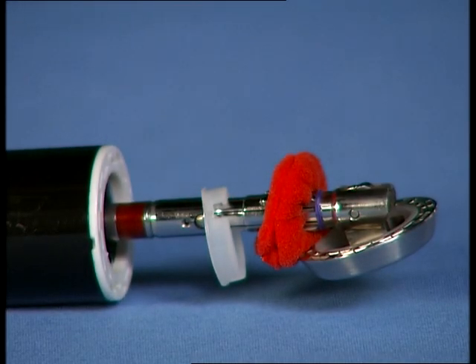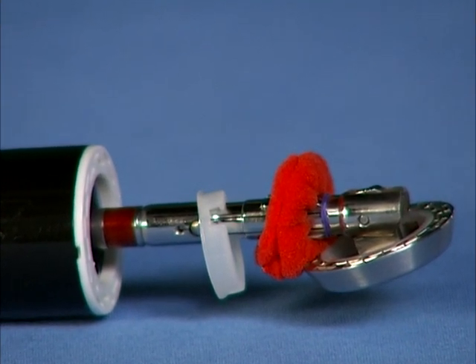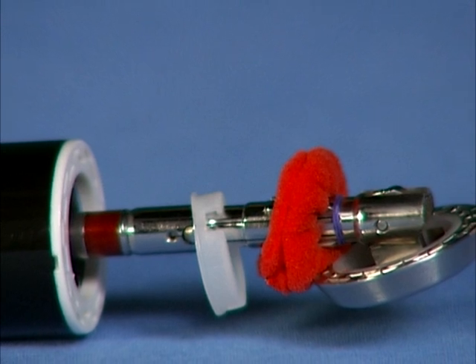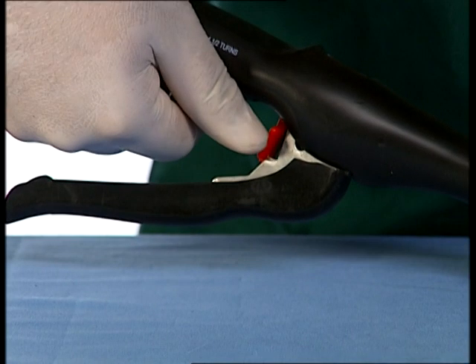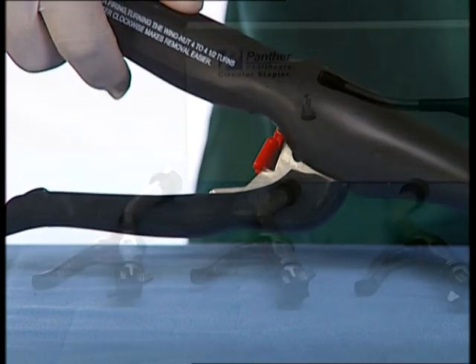Inspect the donuts by removing the detachable anvil assembly, cutting washer and donuts from within the circular knife. If donuts are not complete, the anastomosis should be carefully checked for leakage and appropriate repairs made. The red safety should be engaged before removing the washer and donuts from within the circular knife.